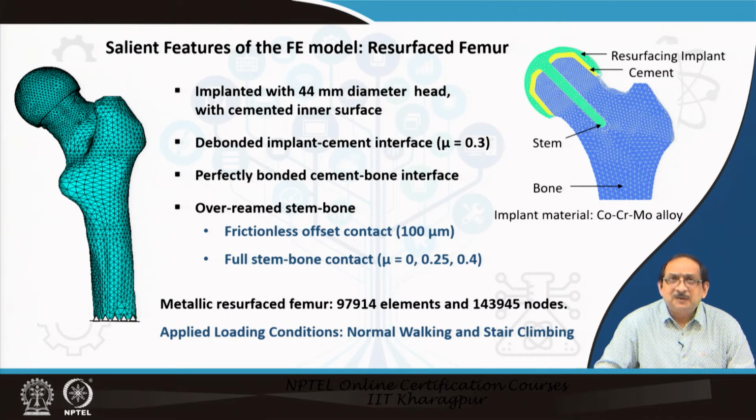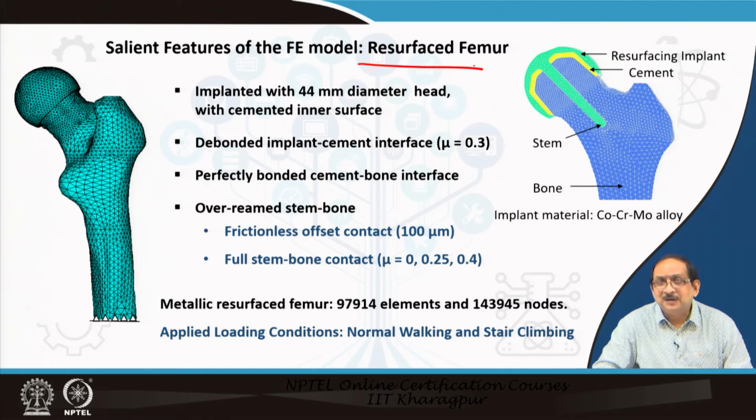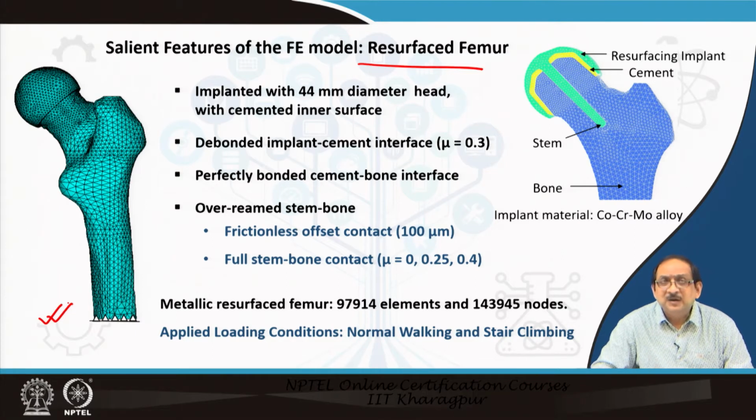Now, let us discuss the salient features of the implanted model. In this case, the implanted femur model is a resurfaced femur model as stated in the slide. A full model of the resurfaced femur is shown on the left, whereas on the right a coronal section of the finite element model has been presented.